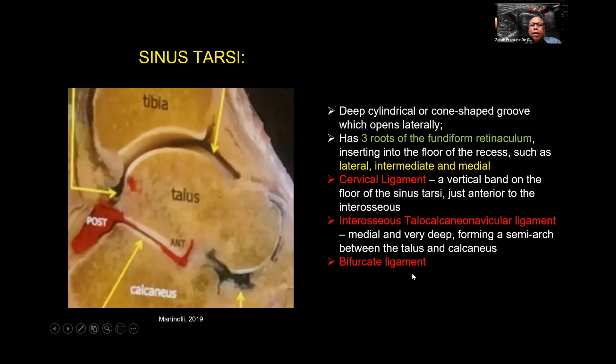Deep and medial is the interosseous talocalcaneonavicular ligament, forming a semi-arch between the talus and calcaneus. The bifurcate ligament is found at the dorsal portion, with one branch from the calcaneum attaching to the cuboid and another attaching to the navicular — forming the Y-shaped bifurcate ligament. The sinus tarsi has a posterior joint with a recess extending anteriorly. If there is effusion, it could empty into these spaces. There is also another joint in front connecting to the navicular.